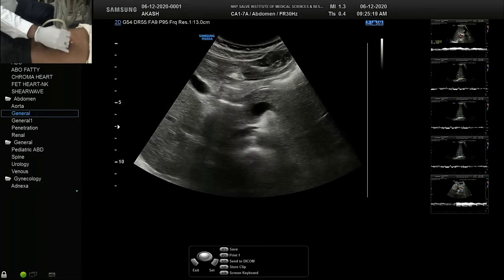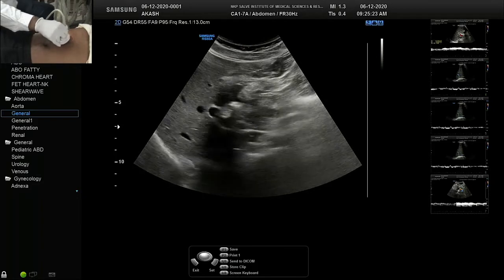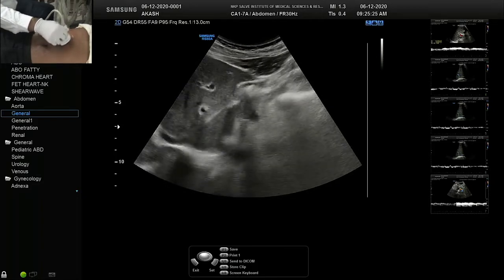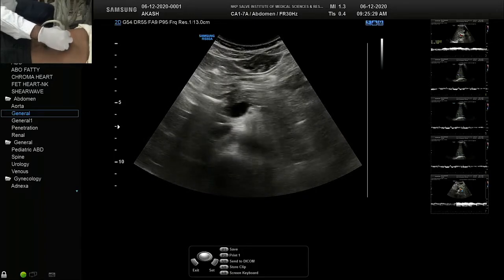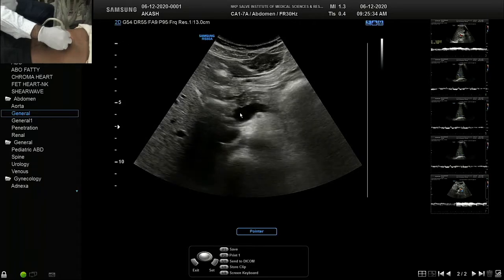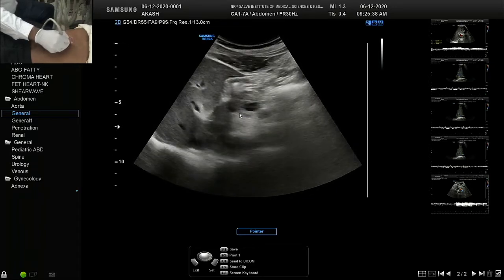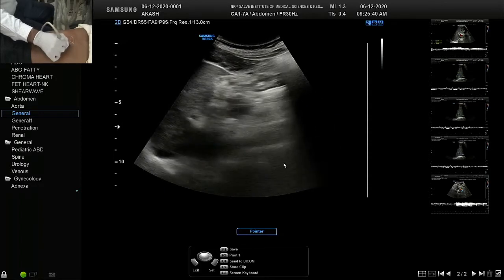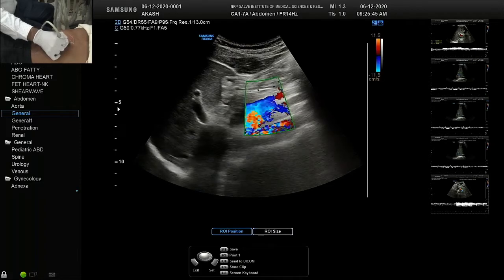Then the superior mesenteric, as we have discussed, from the porta you can directly make a 90-degree angle. While moving the probe, you just keep the confluence at the side. That is the confluence portal vein. One end of the probe should be kept there and just make a 90-degree turn. You can see the SMV. SMV constitutes almost 70% of the blood flow of the portal vein.